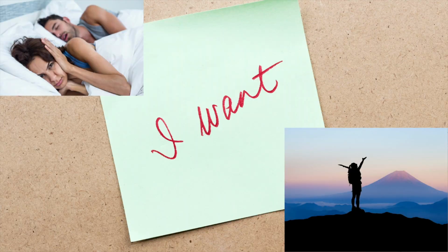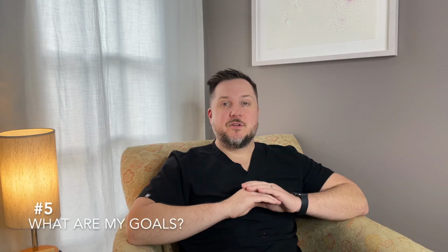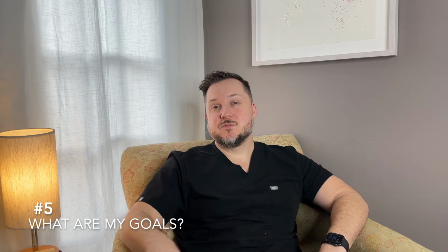Number 5, the last thing is to know what your goals are. Are you going to be satisfied with nothing less than zero sleep apnea, no snoring? I mean, that's great, but most of the time it doesn't happen. The results are that on average, your apnea index is going to go down by 70 to 80%. That means that if we're looking at 100 people, some people might go down by 100%. Some people it may go down by 50%. There's a range. Rarely you may not improve at all. And so it's always a risk, and just like any surgery, there's not a guarantee.